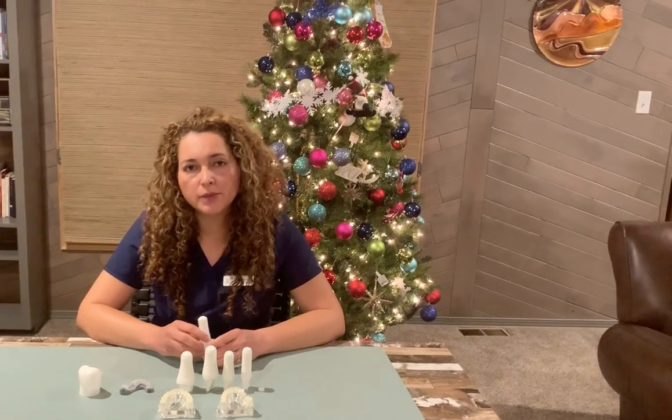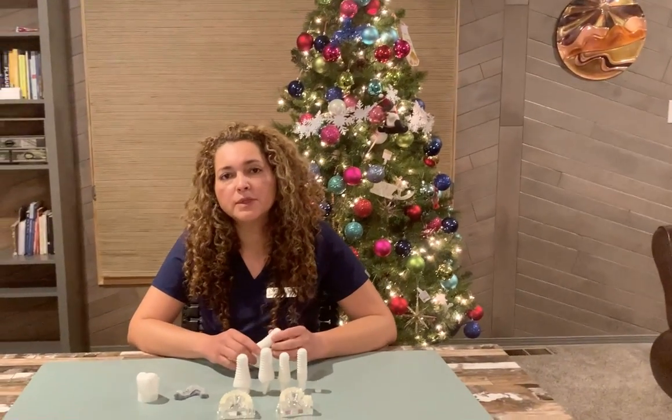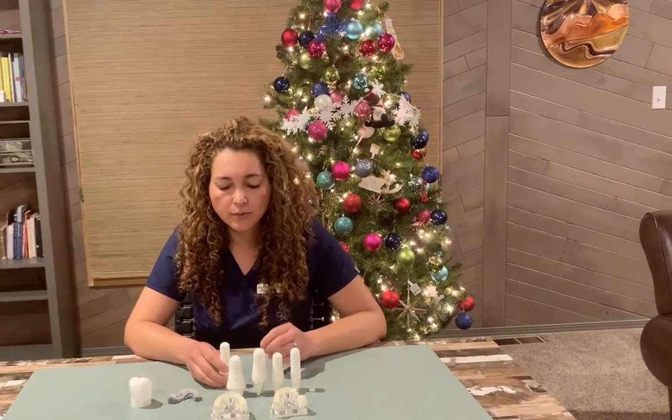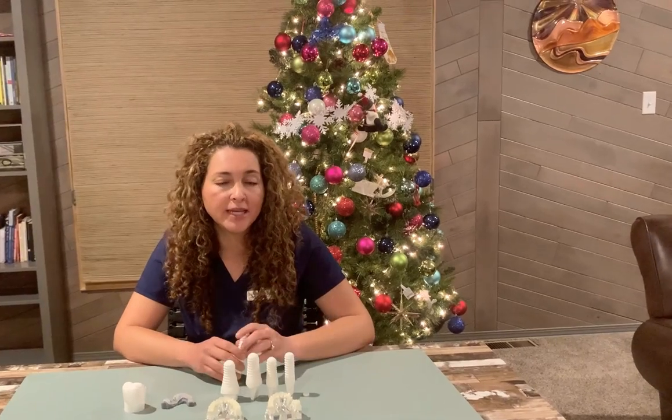We use in our office the Seren root implant. There's a ceramic zirconia system that is very biocompatible. The first thing that we do is we take a CBCT — a computerized tomography — so we can see how the bone is and if you're a good candidate for an implant.